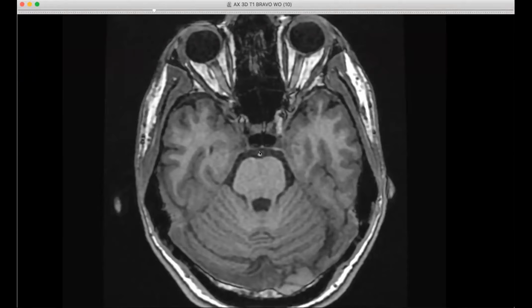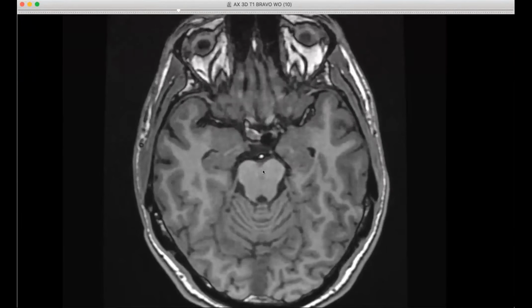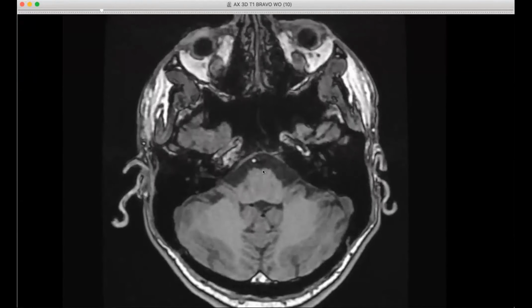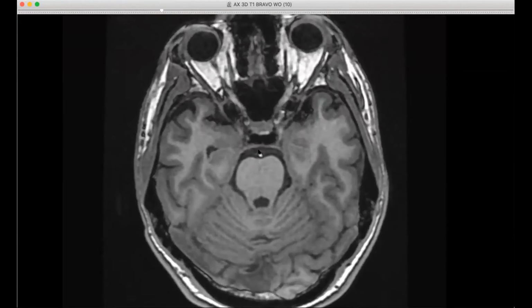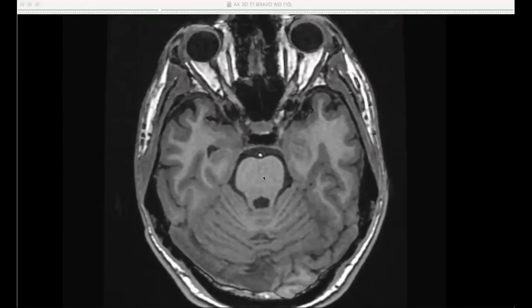What is this bright spot? Oh my God. That you can actually track through the slices. See this bright spot? Oh, and now it kind of moves around. That's an artery. That's an artery. And there is actually a reason why it's very bright. And it's not just T1.